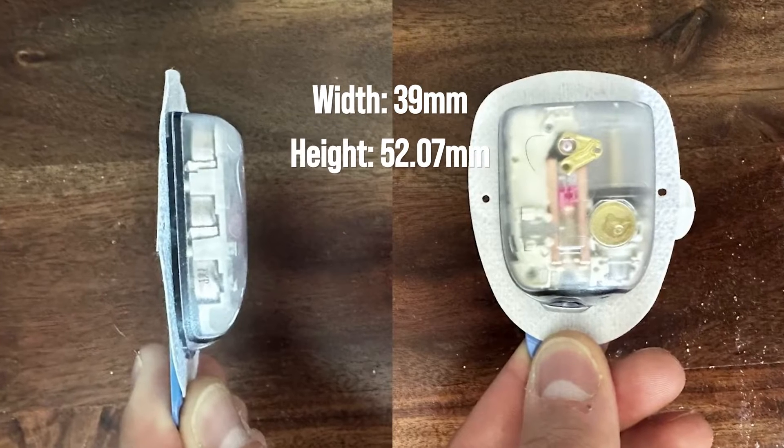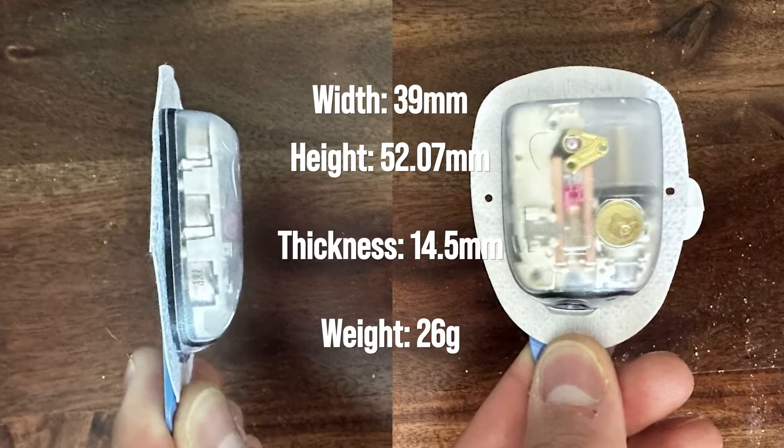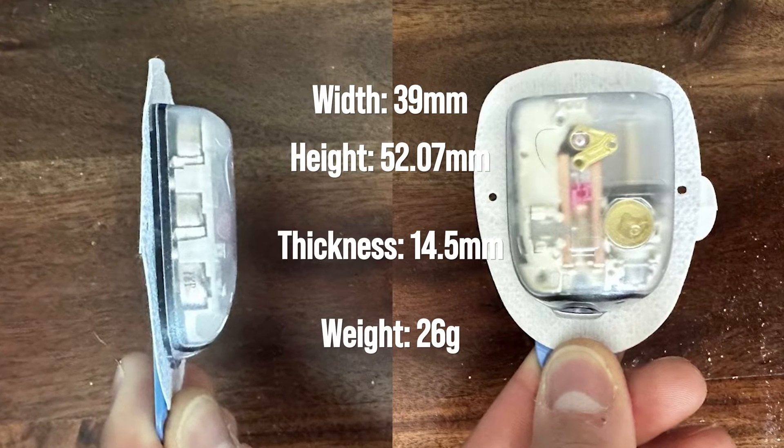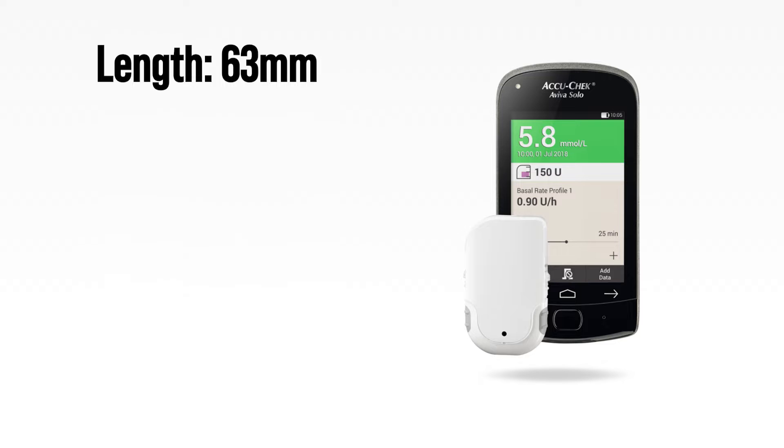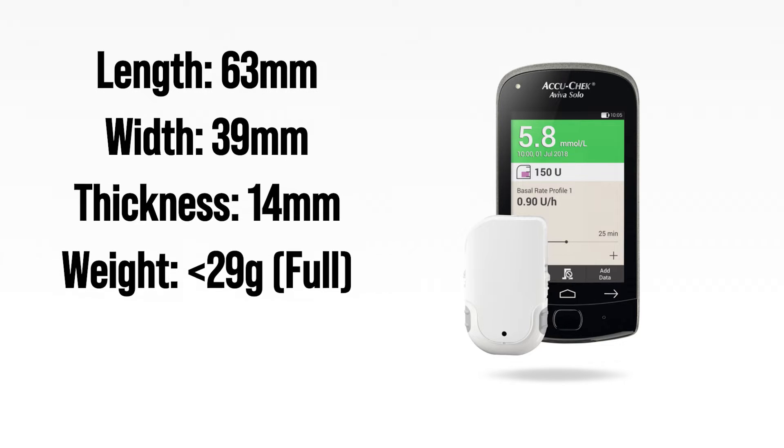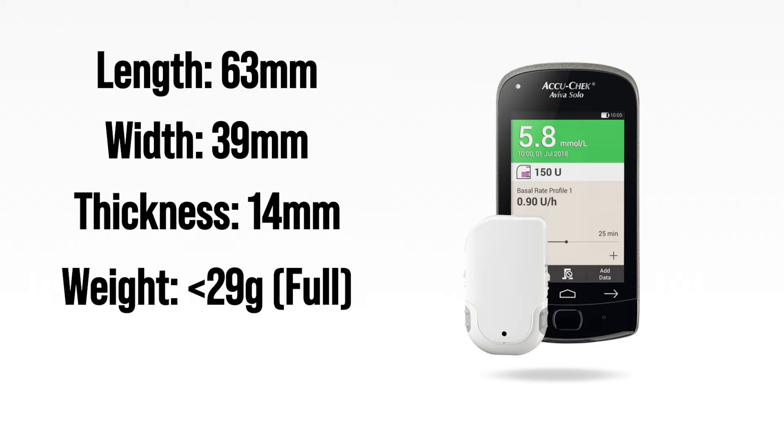It works with insulins such as Humalog, Novolog, Novorapid, and Fiasp. Size-wise, it's pretty competitive compared to Omnipod. The Omnipod is 52mm long, 39mm wide, and 14.5mm thick, weighing 26 grams with an empty reservoir. The AccuCheck Solo is a bit longer at 63mm, the same width of 39mm, and just slightly less thick at 14mm. Roche says it weighs less than 29 grams with a full reservoir, meaning with an empty reservoir they likely weigh about the same.